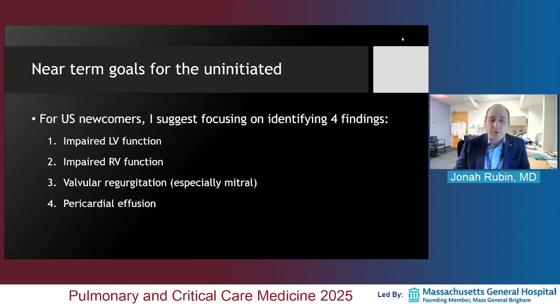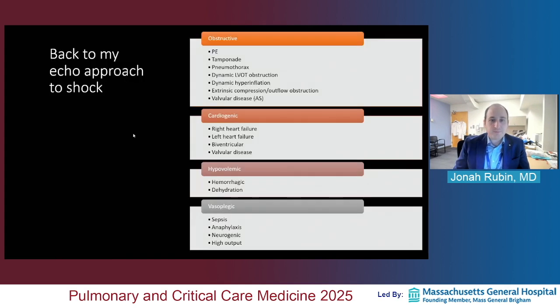I think these are the things, if you're just learning critical care ultrasound, these are the first things to make sure that you're able to do. These are important things to determine and identify early, especially in a medical ICU, because they'll significantly change management from what you otherwise might assume or think was simply septic shock or some other form of vasodilatory shock.